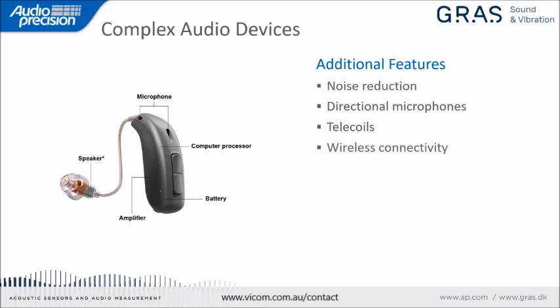Many of them have wireless connectivity. In earlier days, most of the hearing aid manufacturers had their own proprietary Bluetooth protocols for transmitting audio, and now the Bluetooth SIG has just come up with a standard for hearing aids that will allow all manufacturers to adopt the same standard, and I think we'll really see Bluetooth take off from there. In addition, they can have remote controls. For example, you can control the programming and the features of the device from a smartphone.